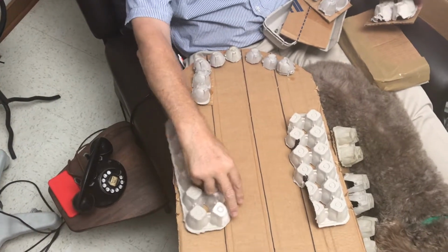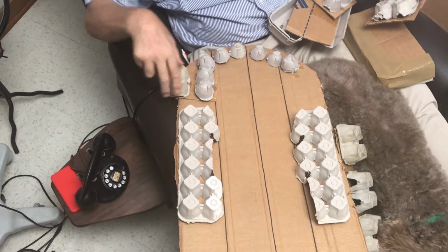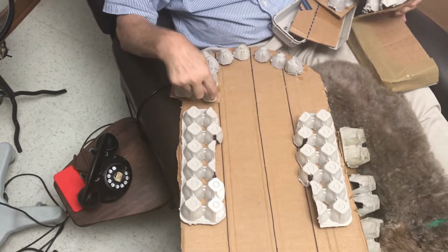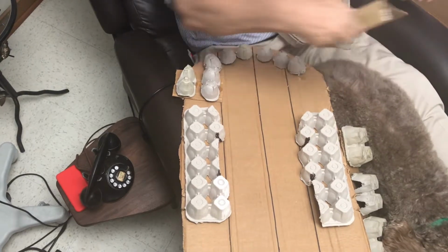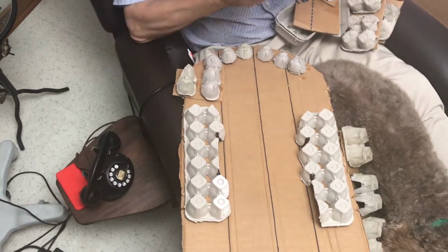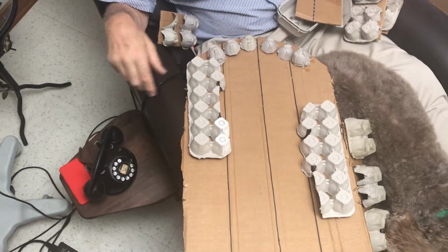The tongue comes in off of this, pushes over here, hits that, and then comes on up, and you have created on the appliance this anatomy, so that you're actually guiding the tongue right up back to where it should be.